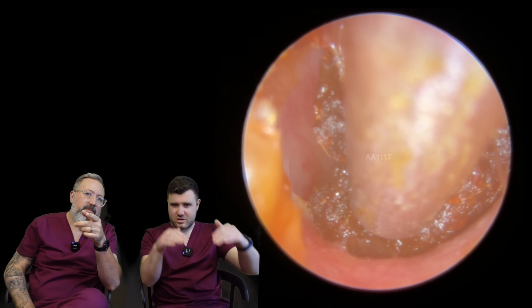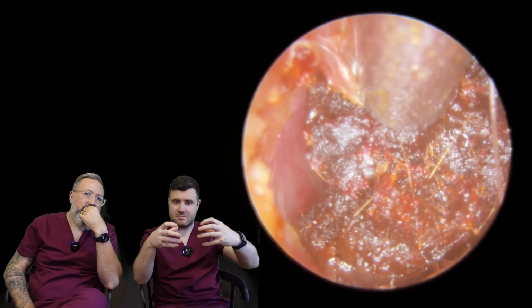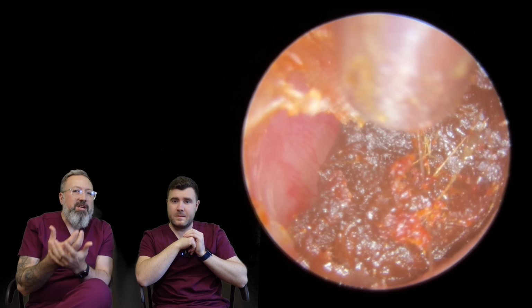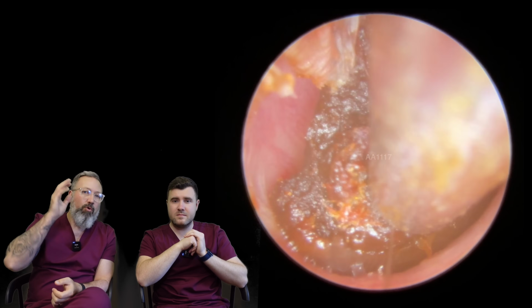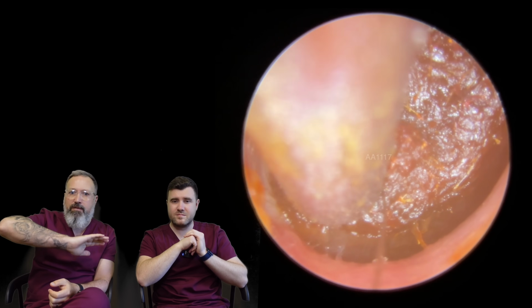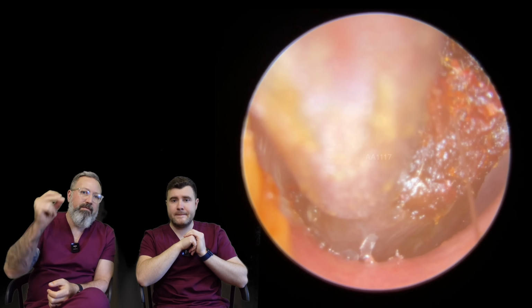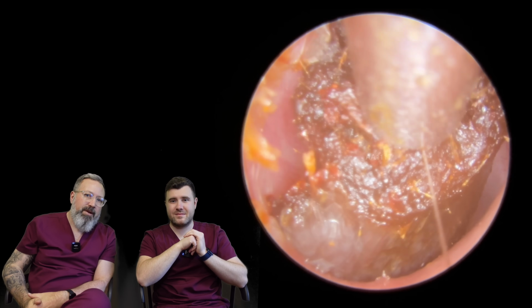The oil is just to try and get around the sides of that plug, so that it should slide and come away a bit easier, basically. And when you get that kind of chewing gummy wax we were talking about earlier, that wax naturally wants to stick to the canal all the way down. So if you don't line the canal with a bit of olive oil, you get this plug moving and suddenly it sticks again, and then you're having to unstick it. Yeah, it's kind of turned a little bit now.